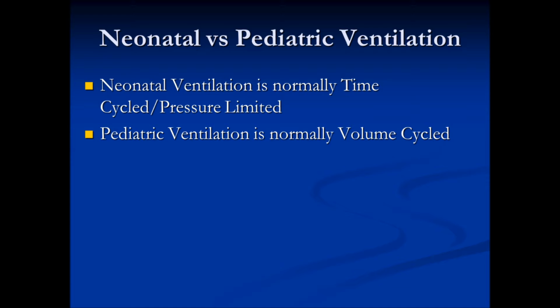So we limit the amount of pressure that we are using to deliver the breath, and we are using time to cycle the breath on and off. With pediatric ventilation, it is just like what we do for adult ventilation, and that would be volume cycled.